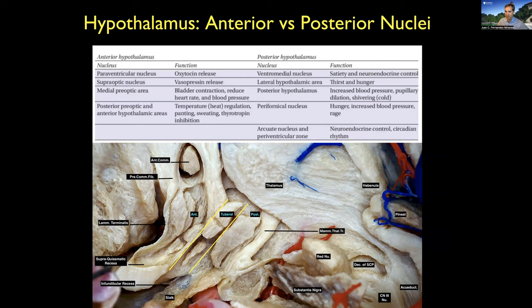This is the tuberal nuclei we are exposing. The retrochiasmatic line is here — in front of it, we have the anterior hypothalamus that we need to be very careful to preserve. As tumors get into this anterior hypothalamus, involving the suprachiasmatic recess and anterior commissure, we are dealing with risks of temperature dysregulation. Hyperpyrexia, for example, can be a very significant post-operative side effect. Posterior to the retrochiasmatic line, we have the posterior hypothalamus with the mammillary circuit involved in memory and cognition, and also areas that control hunger.